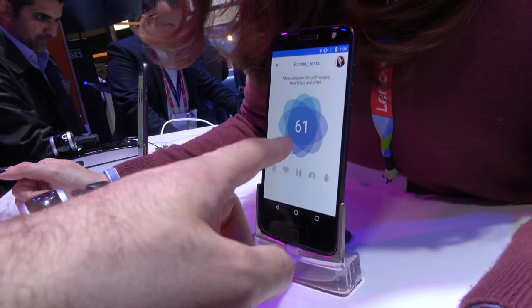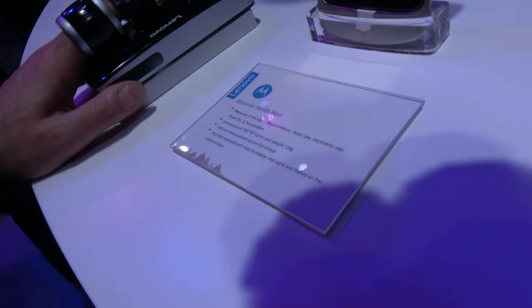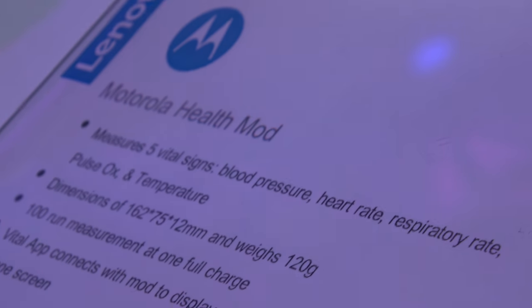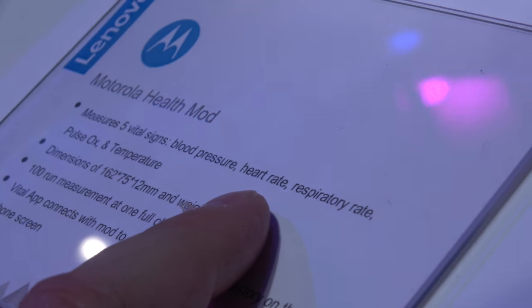We can see the countdown — he has 60 seconds left and it's taking all five vital signs. These are very important measurements. The blood pressure alone is like a trillion-dollar industry. People have blood pressure issues — cardiac issues, high blood pressure, heart rate.